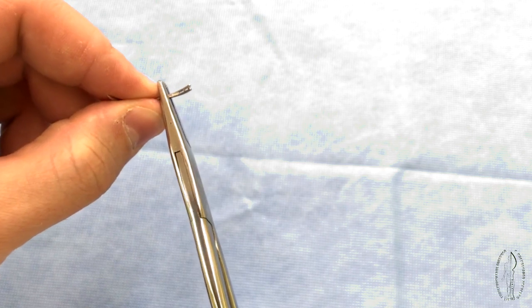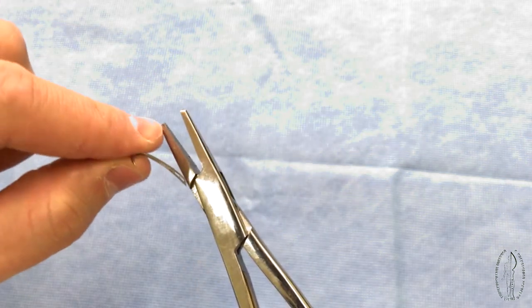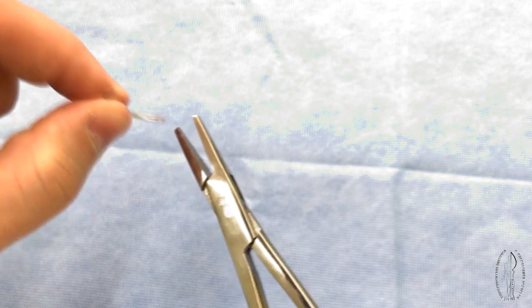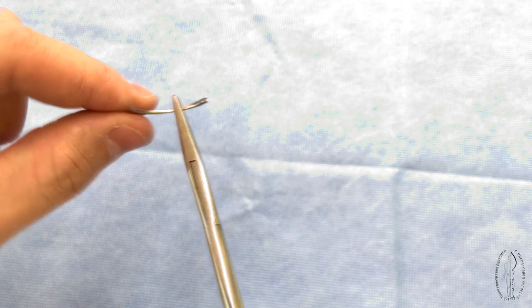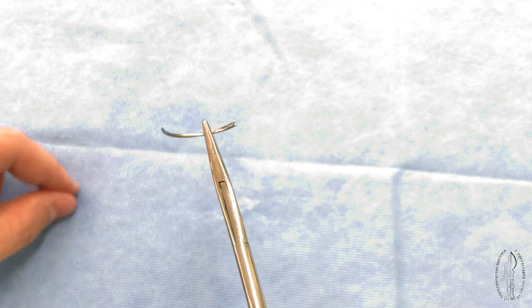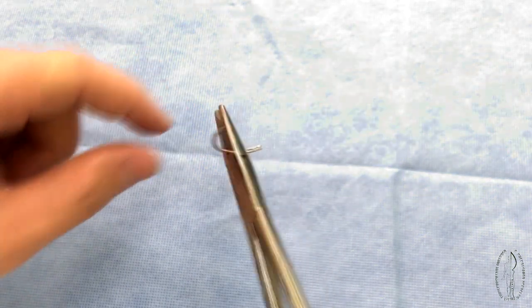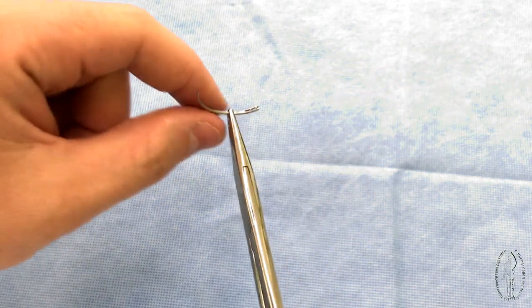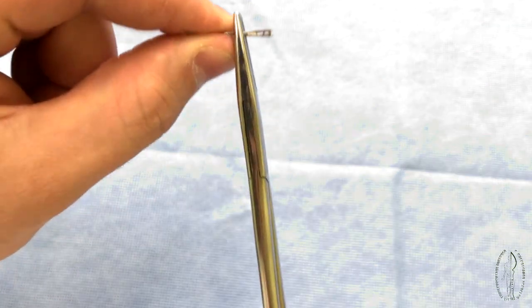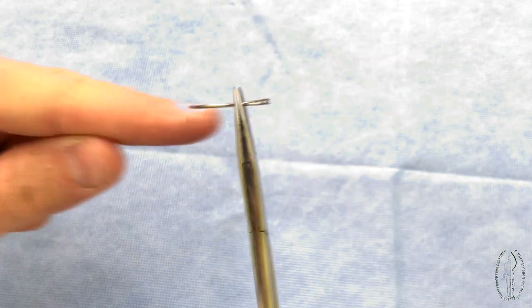The position of the needle in the needle holder should be as follows. One third of the length of the needle holder branches is directed to its tip, and two thirds to the lock. The closer position of the needle to the lock spoils a needle holder. Over time, the ability of fixing the needle in the correct position decreases, and a protruding tip creates difficulties with making suture in the depths of the wound.